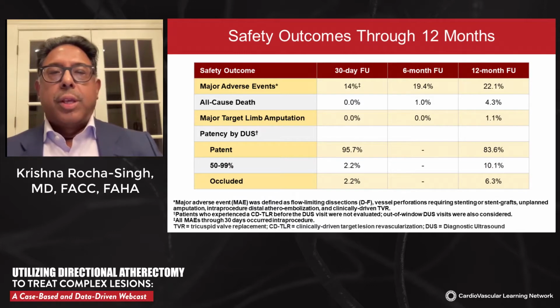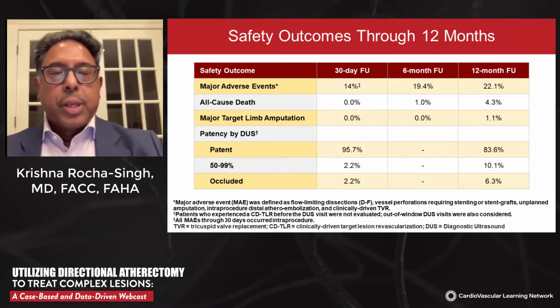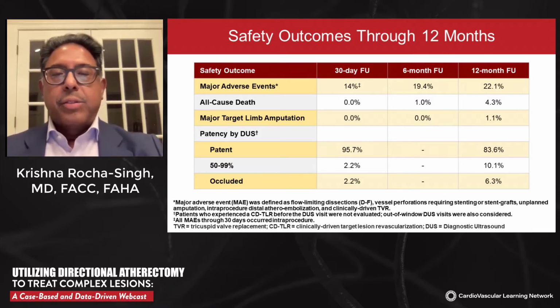So here you see the safety outcomes as it relates to 30 days, 6 months, and 12 months as it relates to major adverse events, all-cause death, and amputations. Duplex Doppler defined patency, again, you see at 30 days.